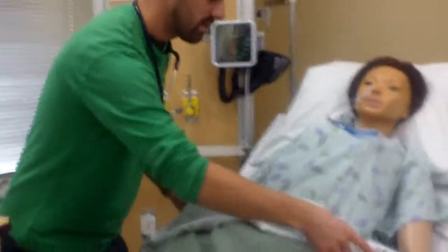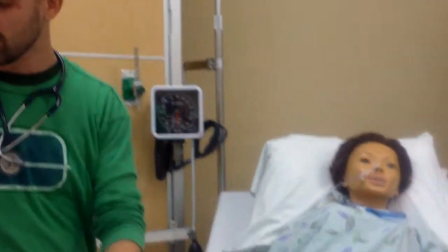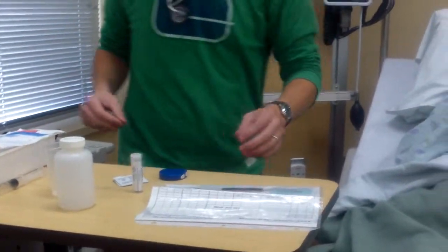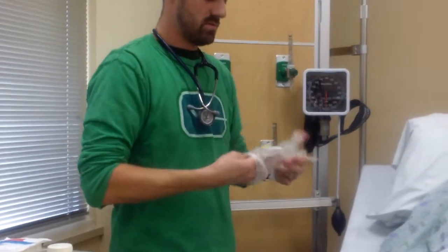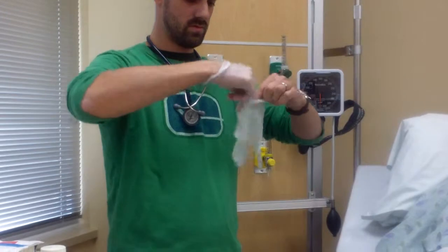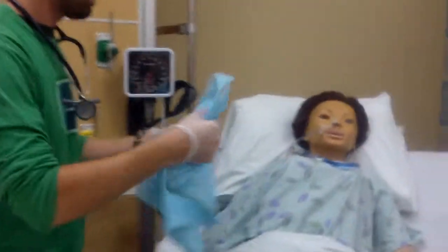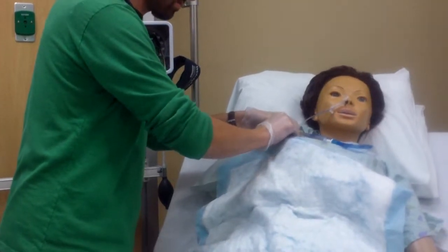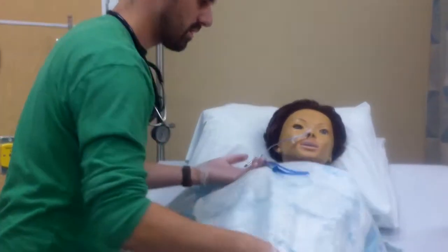Everything checks out. So the next thing I need to do is, on my nurse's notes, I need to check the length. So I brought out my little supplies here. So then I'm going to just put on some gloves. Alright, then I got the chucks from the door. This is just for you. I'm going to unpin that. There we go.